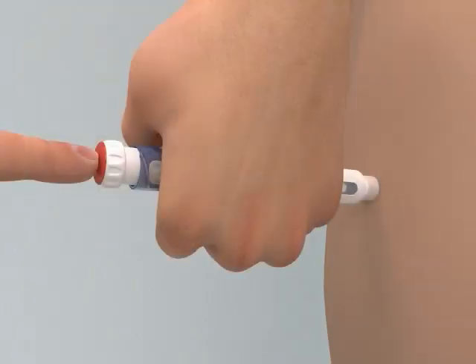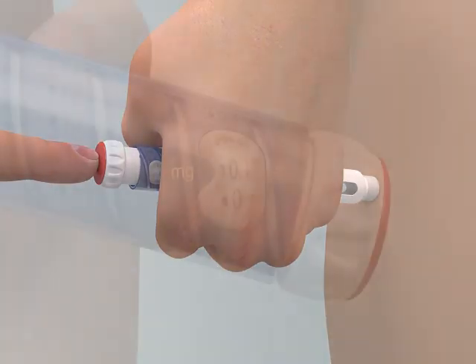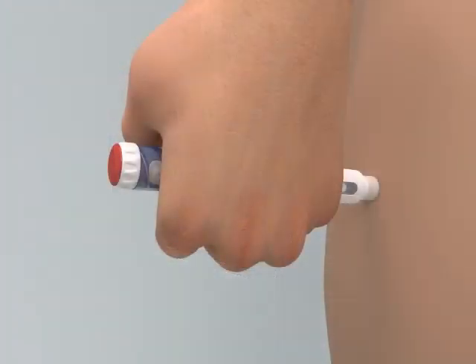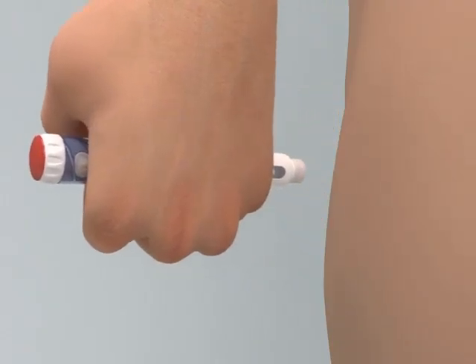If you can't push the injection button in as far as it goes and the dose window does not read zero, the cartridge is empty and the full dose of medicine has not been injected. The dose indicator window will show the amount of medicine still needed to complete the dose. Remove the pen needle from the skin and make note of the number.